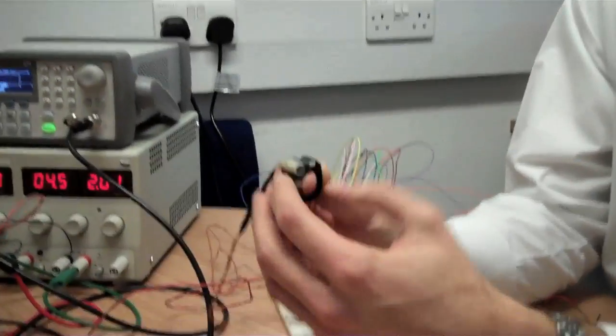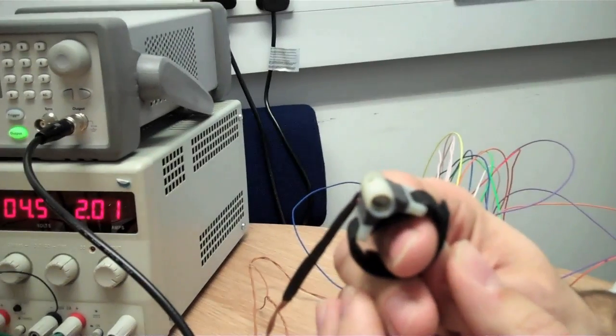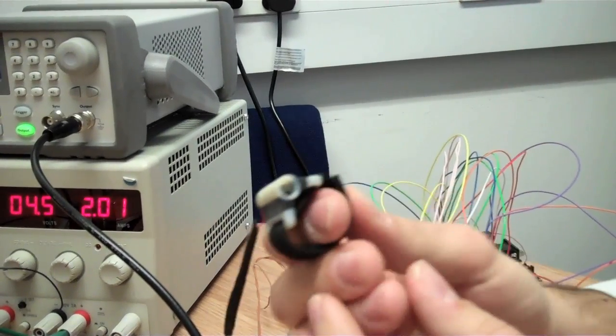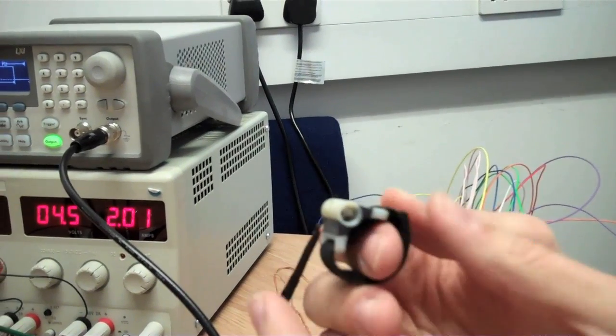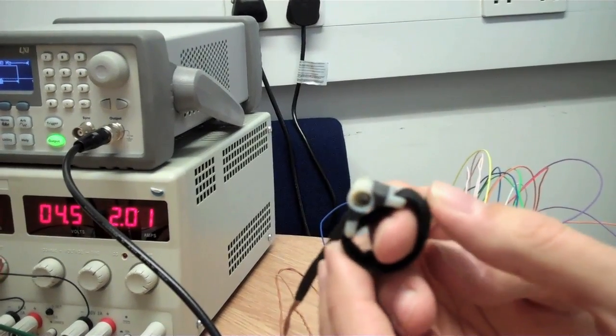The first device we tried out was a vibration device. This is what's commonly used and currently available on the market. It provides a vibration to the back of the fingertip whenever you want to apply it.